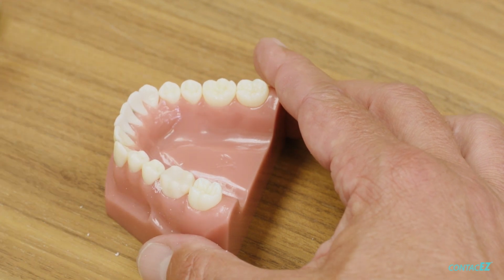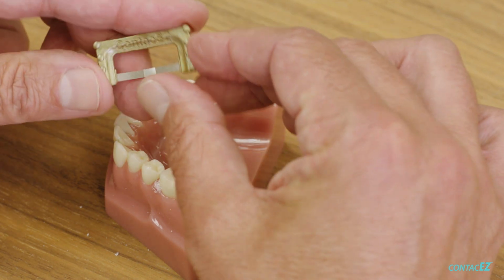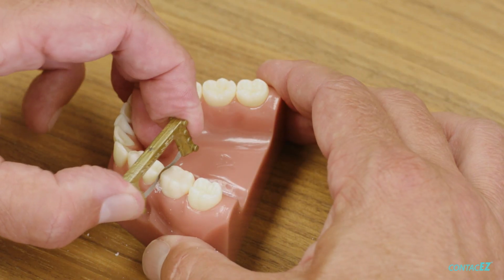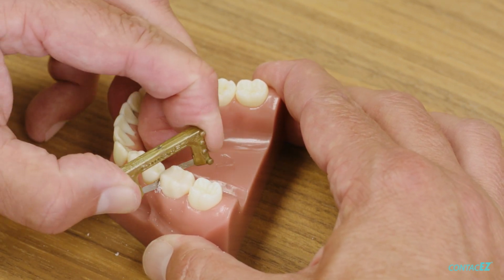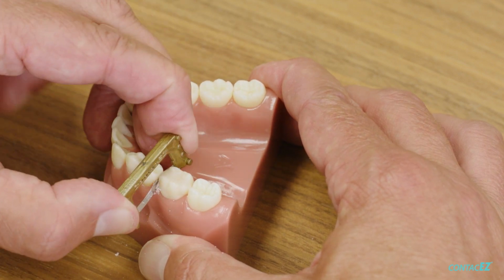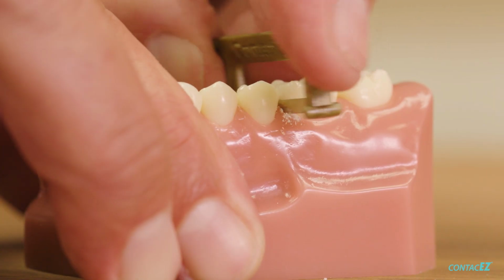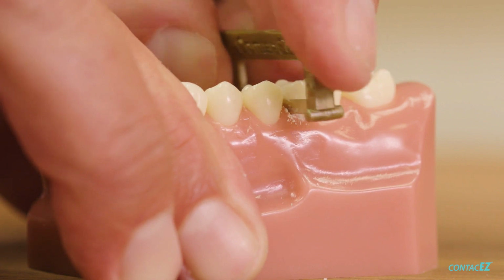And once that is done, again, I can take my gold narrow strip and take the area that's not coated and wiggle that through the contact, and then be able to use the sides of that strip to kind of reshape that composite. So I've cut through that protrusion, and now I'm trying to reshape that so I have a better emergence profile along there.